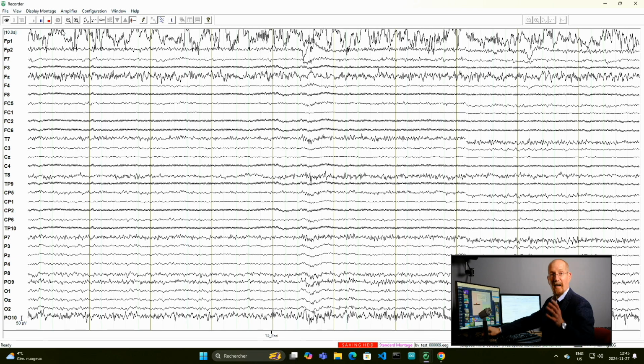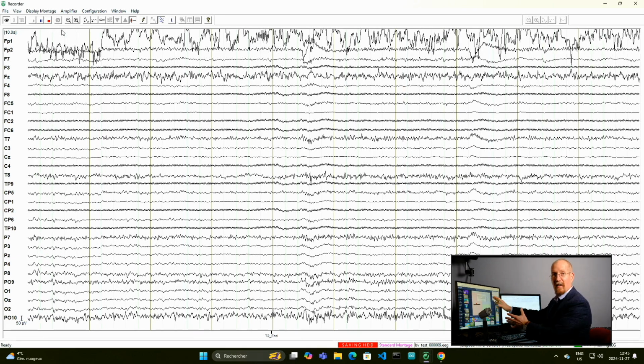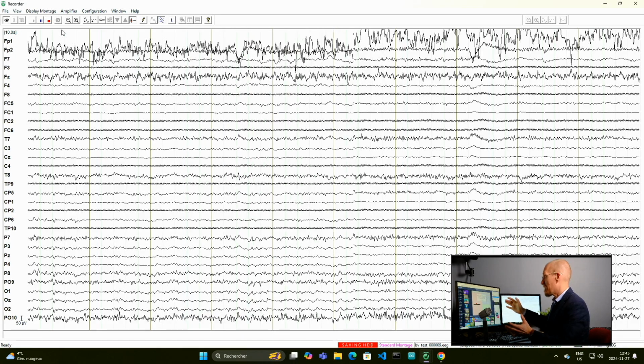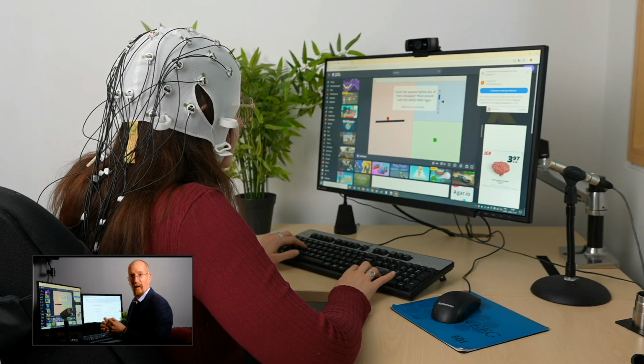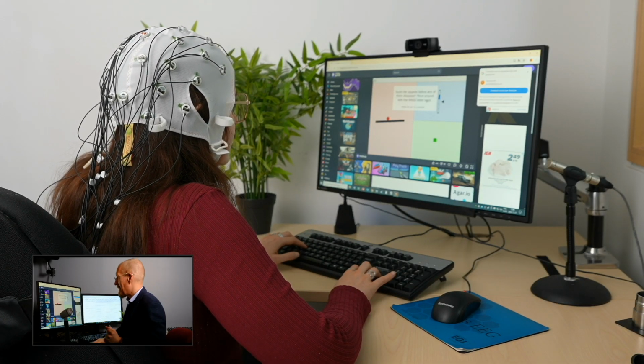Here's an example where I can take advantage of multiple trials. I don't need to analyze the brain activity during this part of the task where she's not doing anything. So we'll make sure that I only analyze parts where she's actually using her brain for performing the task.